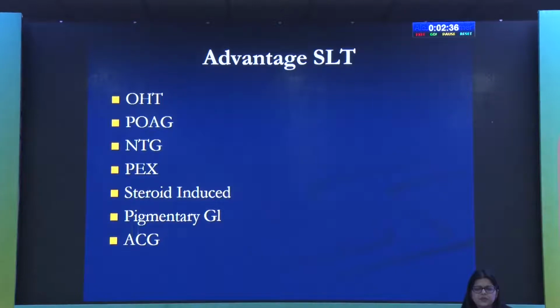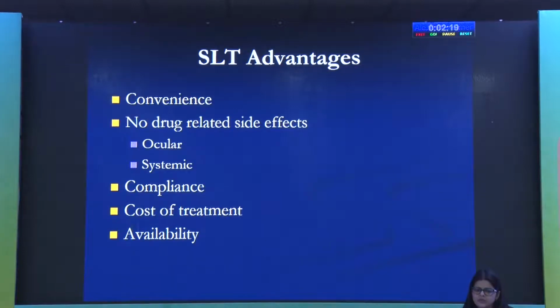So SLT has many advantages. It can be used in different kinds of glaucoma: OHT, POAG, NTG, pseudoexfoliation glaucoma, steroid-induced glaucoma, pigmentary glaucoma, and as you have just seen, even some cases of angle closure disease can be treated with SLT. It's also very convenient to use, with no drug-related side effects. So you can get rid of at least some of the drugs, ocular or systemic. And compliance is not an issue because, if it works, it's going to work for a couple of years at least.